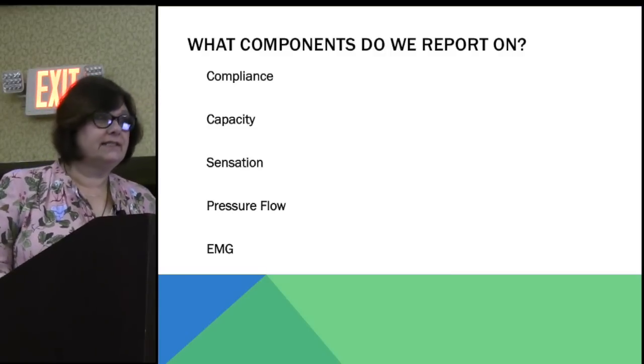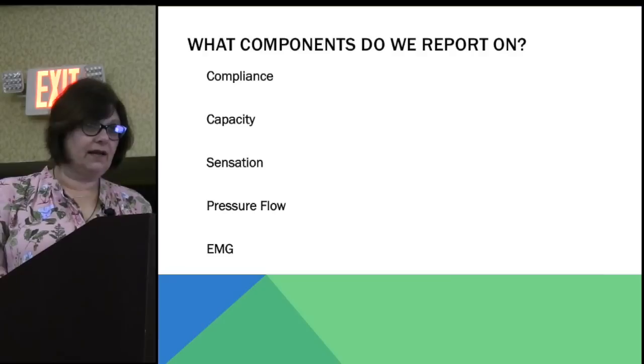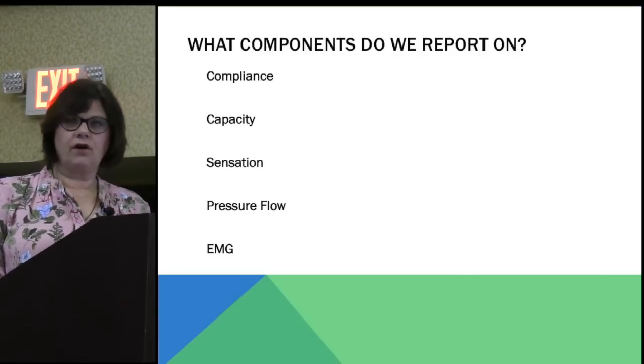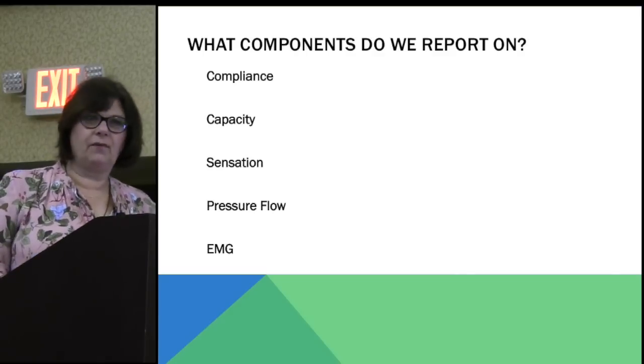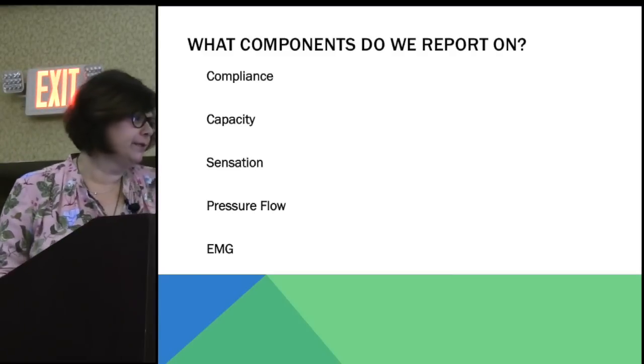And then sensations. Did they realize the sensations? How long did it take them to get to, yes, I can first feel water going in? If somebody first feels water going in at 300 or 400, that's someone without normal sensation, right? They should be feeling that within at least the first 100 mLs, and often sooner.